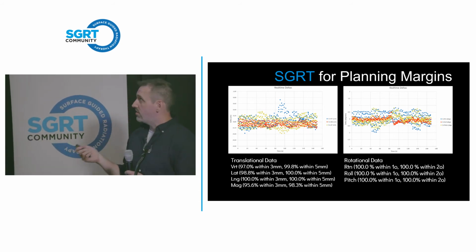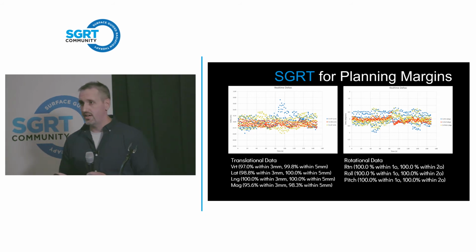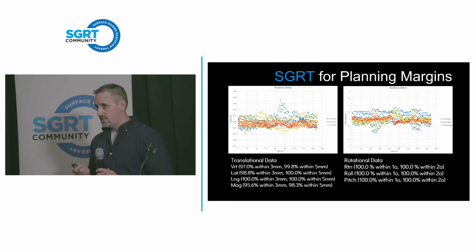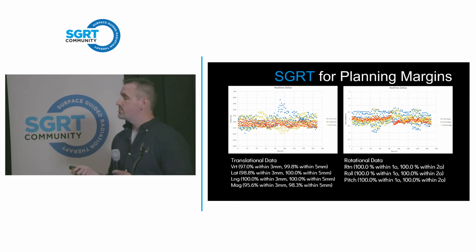And so these are all valuable things to know on patients that have lots and lots of retreats. We do a lot of retreat SBRT where they failed outside of the field at another institution or something like that.